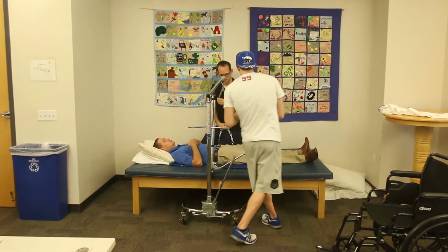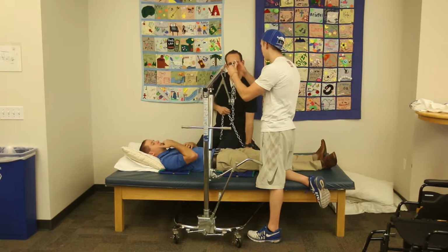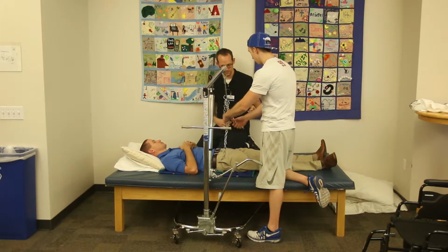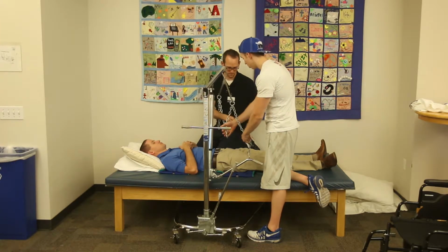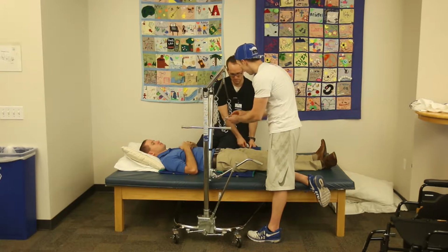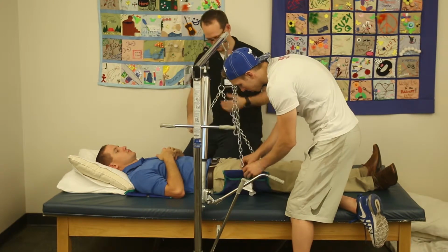Okay, so how this is going to work, Lucas, we're going to take, at the very top is a circle ring. We're going to put that just right here on the hook. Now there's a long and a short side. The longer side is going to come down here, and then the hook goes in so that the hook part of it is facing away from Dylan. Cool, just loop it there.